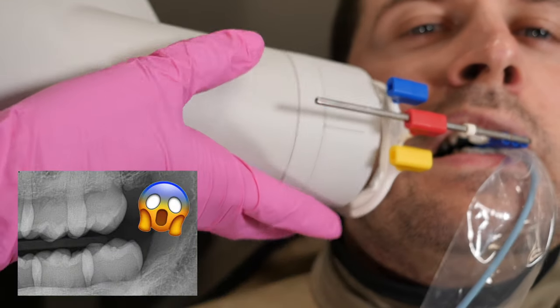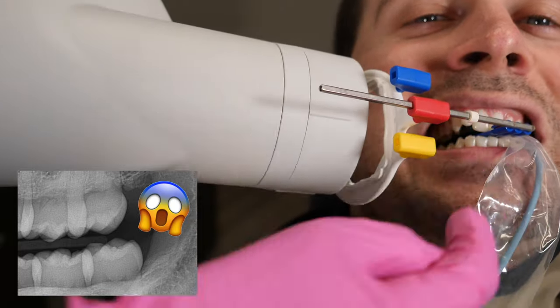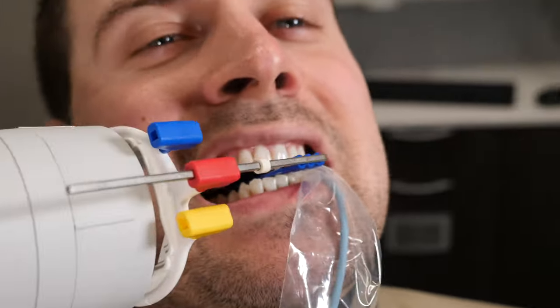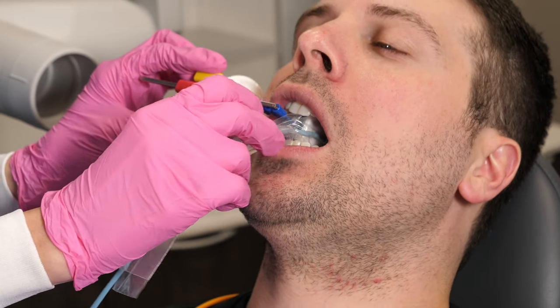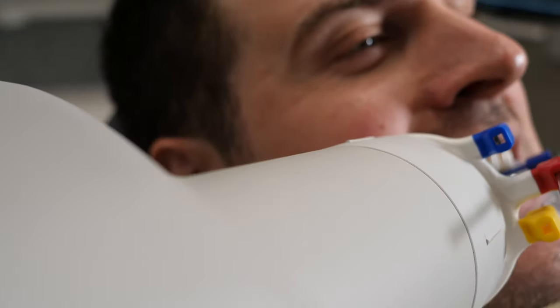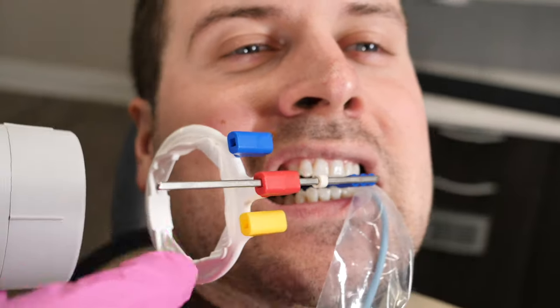Overlapping — this is sometimes super hard for the bite wings molar shot because we are so focused on getting the most distal part of the farthest back molar that we forget about lining up the tube with the teeth. I sometimes ask the patient to smile so I can see their teeth and then I'm able to better envision the tube going through their teeth, versus just lining it up when they are closed and guessing what their arch looks like.